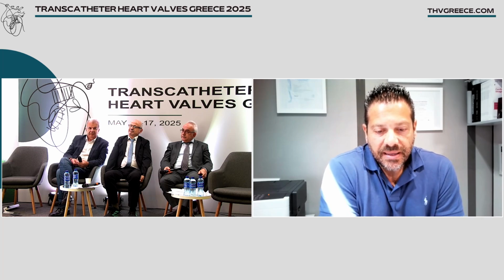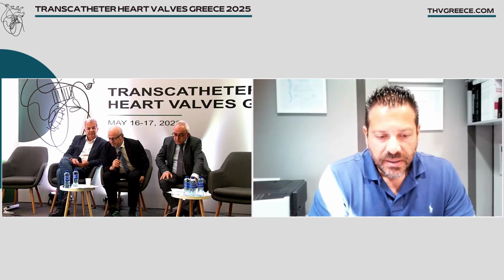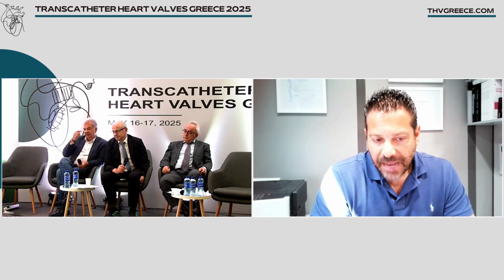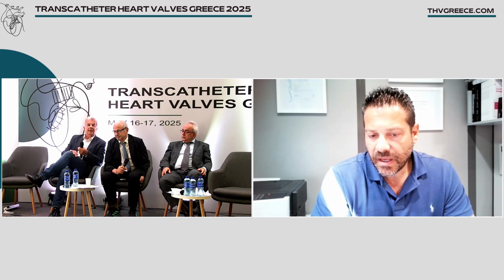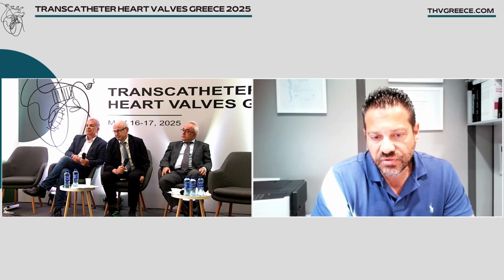For planning the procedure, I think the anatomic criteria that we presented before are enough for deciding if the patient is suitable for TEER. So if we don't have a gap, if we don't have leaflets, if we don't have, for example, a location that comes from posteroseptal, then we don't have issues for edge-to-edge repair.